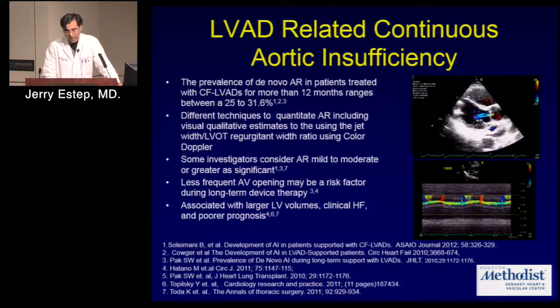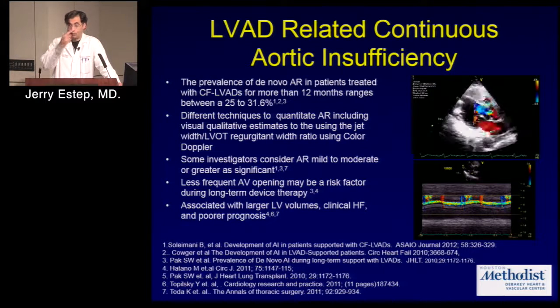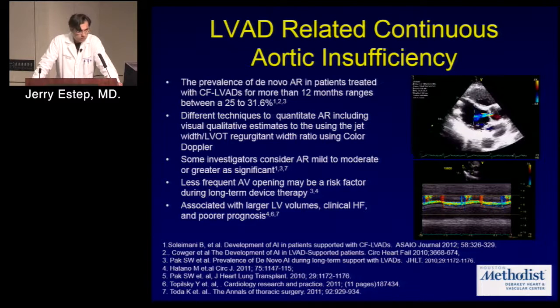Now, of all the valve challenges post-implant, the number one we see is mitral regurgitation in the setting of a dilated cardiomyopathy, a ventricular dilatation. We do see some ischemics that have a smaller heart with tethering of the valve. Most mitral regurg washes away with LV unloading.